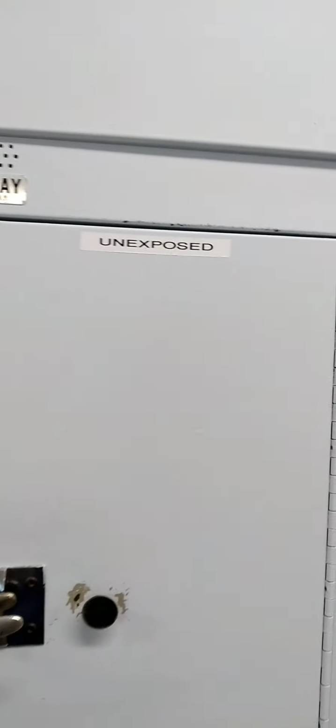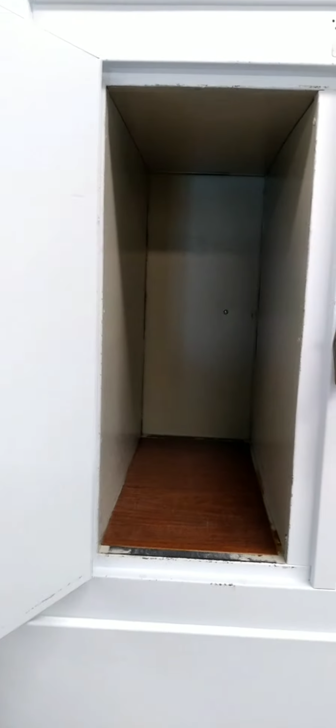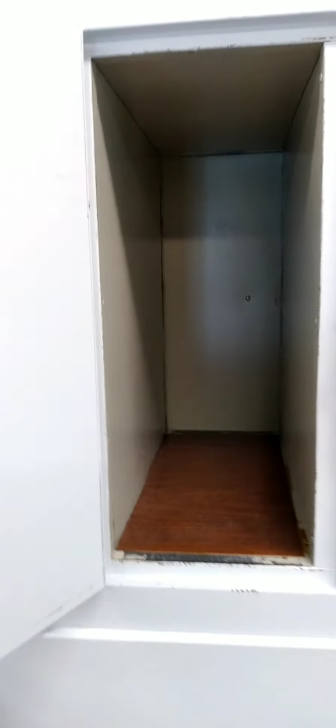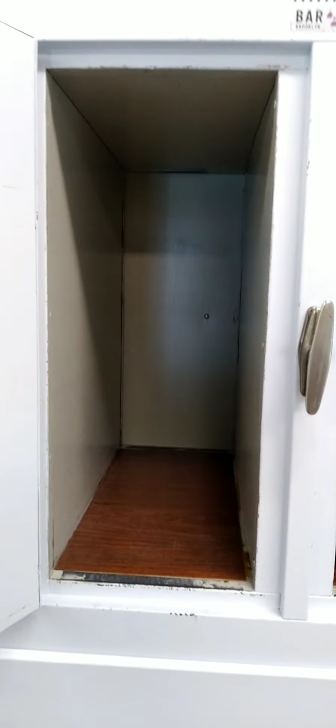The left side is exposed, the right side is unexposed. That means exposed or unexposed in terms of radiation. So if I were to get a cassette out, opening both sides, these cassettes here are unexposed. That means they're ready to go, ready to use. They don't already contain an image. Other side currently is empty. So there's no x-rays that have been exposed that need to be passed through into the darkroom.